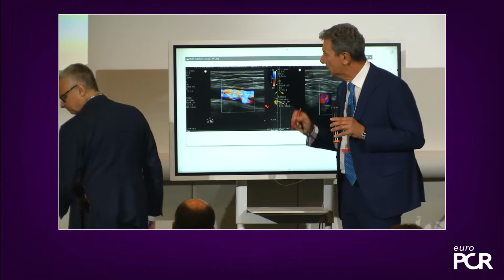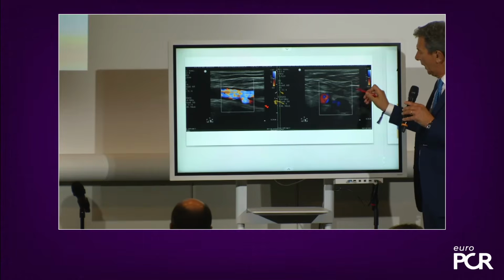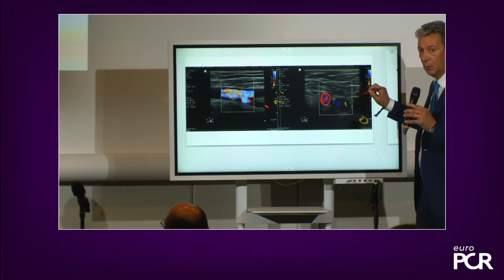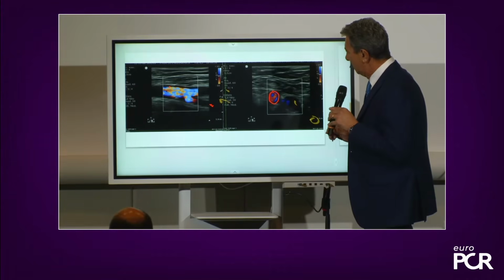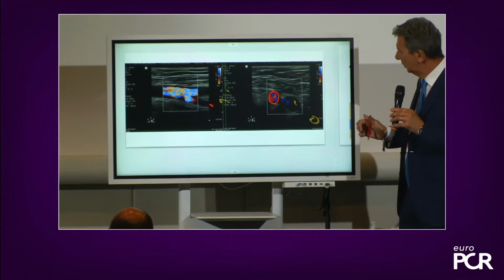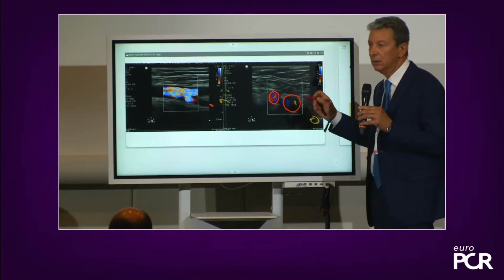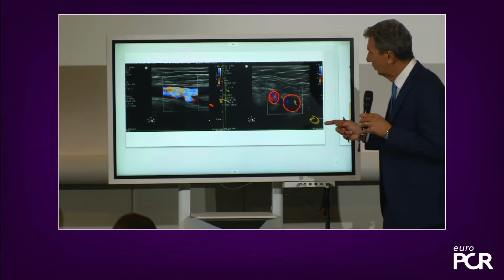You rotate the probe 90 degrees, as Ole showed, and you will have in front of you an image like this one, two vessels. The first step is to understand which one is the artery and which one is the vein. There are some tricks. First, the color. The second is that with a mild compression the vein tends to collapse, because usually the vein is more medial, but in the case that Francesco showed, the anatomy is probably inverted.